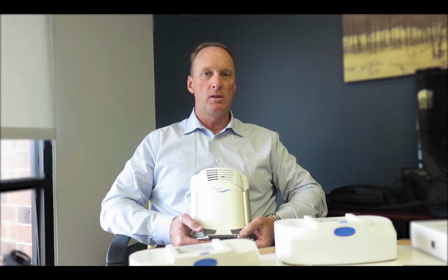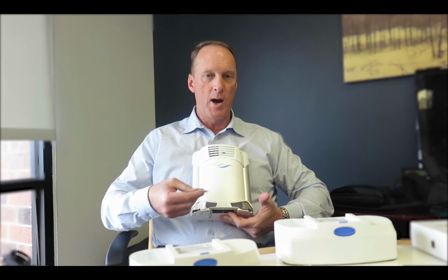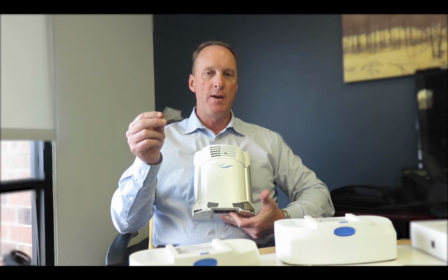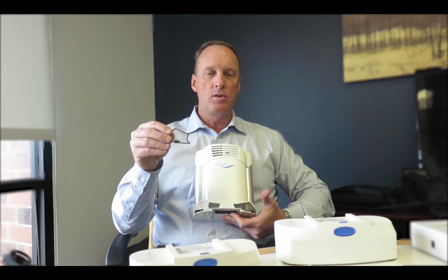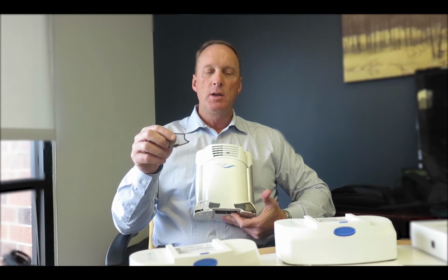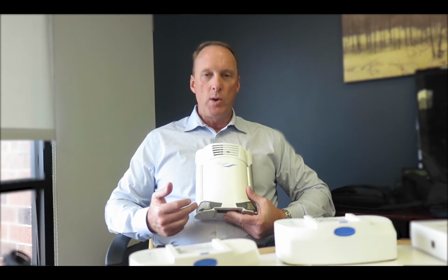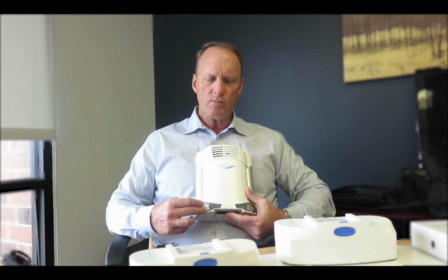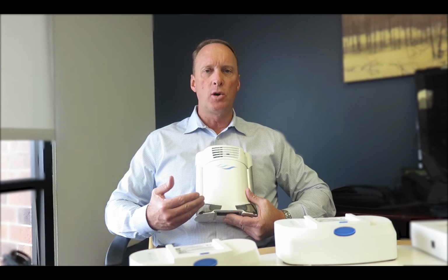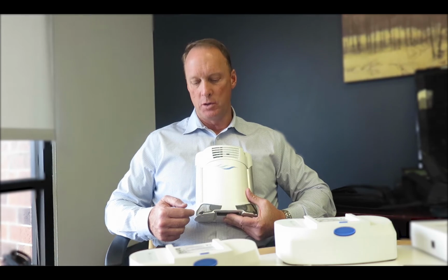The great thing about the Freestyle Comfort is it takes very minimal maintenance or care by the actual patient here. There's two gross particle filters, one on the left and one on the right. They're very similar to the filters you have on the dryer, in your laundry room here. To clean the gross particle filters, you just want to use a little bit of soapy dishwater, wash them out, and then dry them because it is an intake filter, and then you just put it right back onto the unit again. We recommend that the patient clean these about every 2 weeks if it's in pretty frequent use, or if they see some visible signs of dust or cat hair or things again that look like it's impeding the flow of the actual filters.